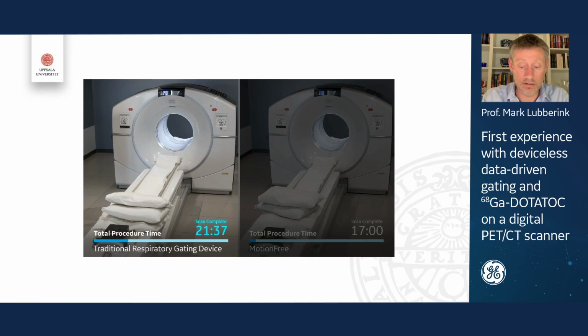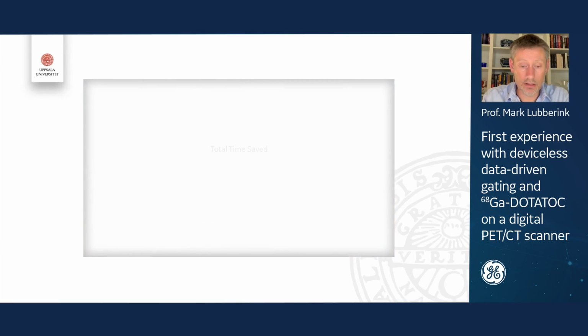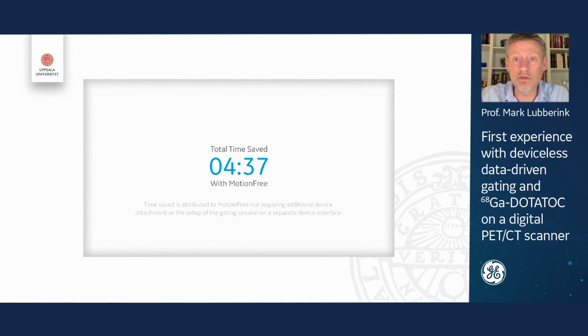So there is some time gained there, but I think that's not explaining all of it. If you ask our technologists, then the hassle with external device gating actually takes much more time than these 4.5 minutes that were shown in this video.